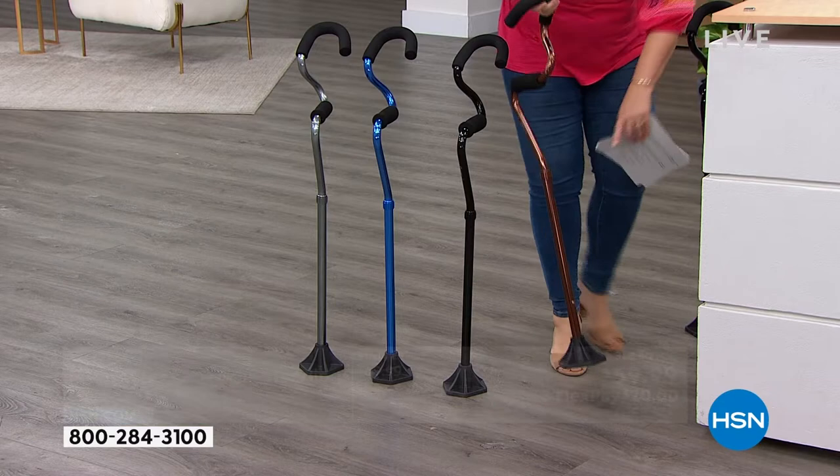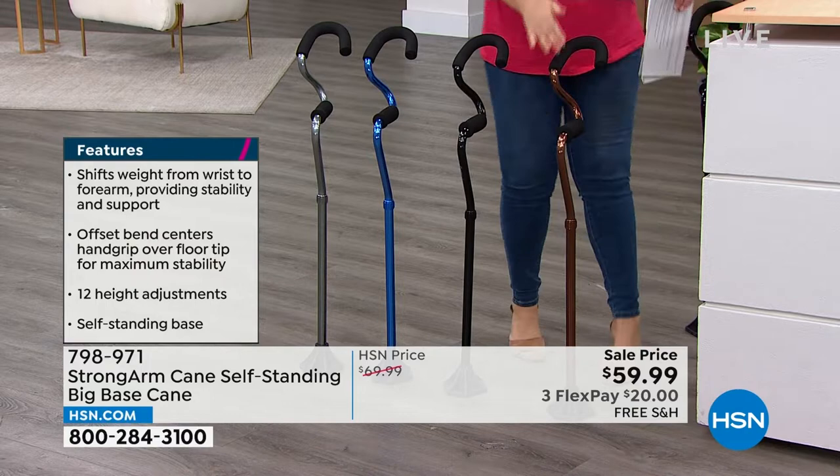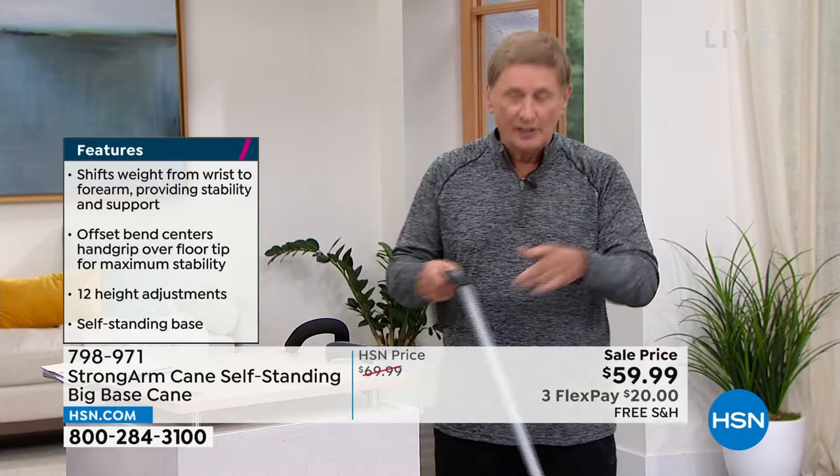12 different height adjustments and settings. Super durable, well made, and that unique design is everything. Every time we've had this on it has sold out without a doubt. But this is the first time with the big base, which we'll show in just a moment.